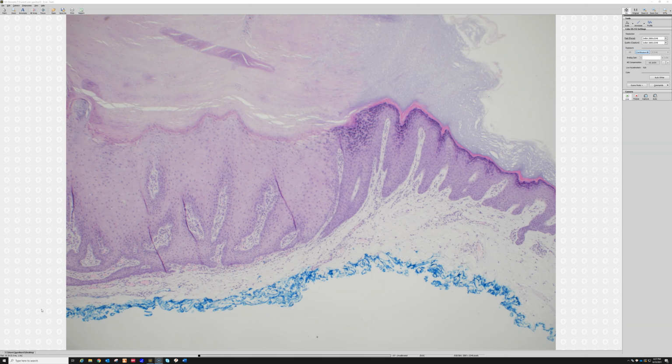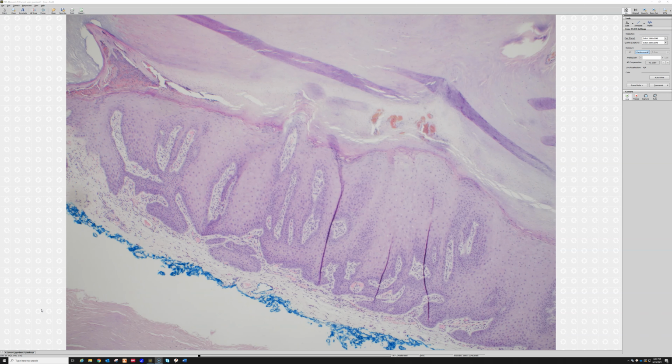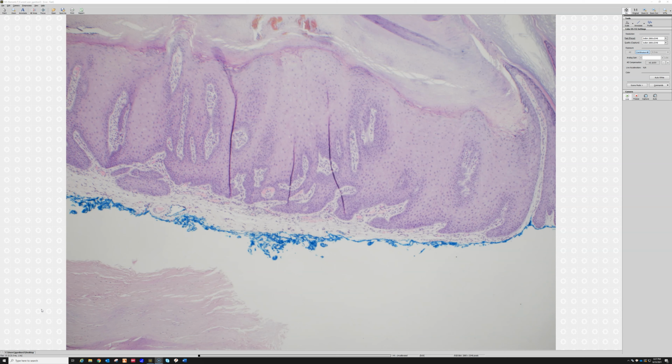So I'm totally not blaming you. I recognize the struggle's real, and I totally understand not wanting to do a deeper biopsy. But on keratotic lesions, a deeper shave that lets me see the whole base of the lesion, to me at least, I don't know about other dermpaths, but for myself at least, makes it much easier to give a definitive answer without hedging. And with a transected one, a lot of times I have to hedge because I just can't see what's happening underneath. So if you're able to do that, it's going to help me give you a better answer.